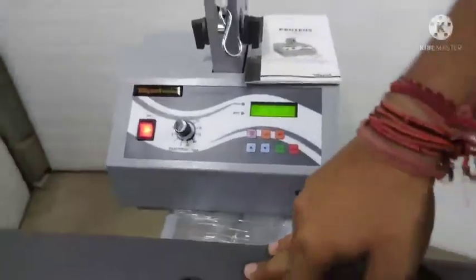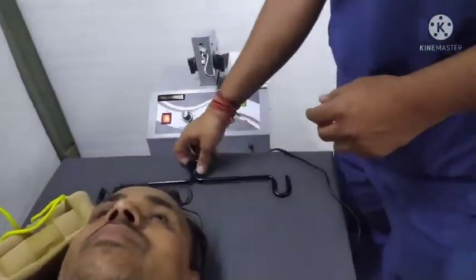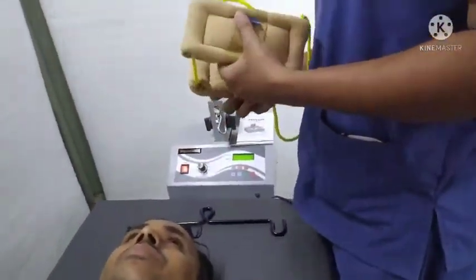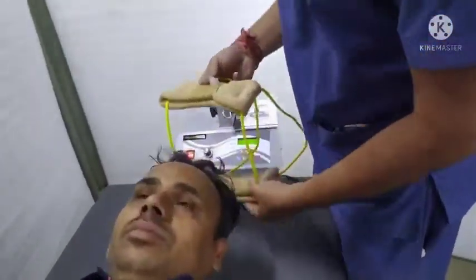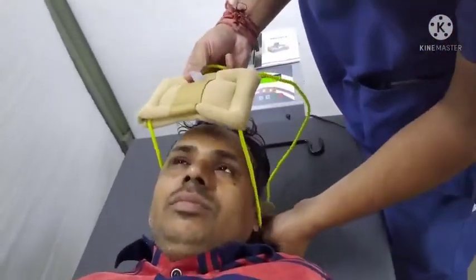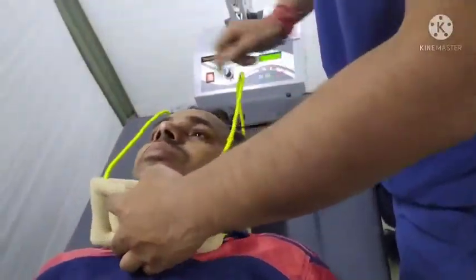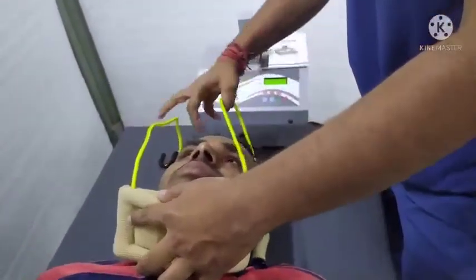Okay, now we apply the cervical collar to this patient. We are giving cervical traction in supine position, so we place the cervical collar like this.